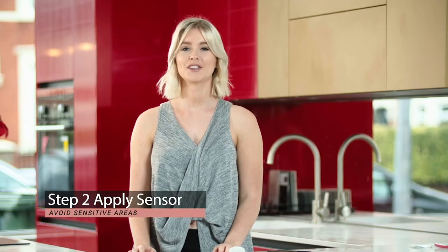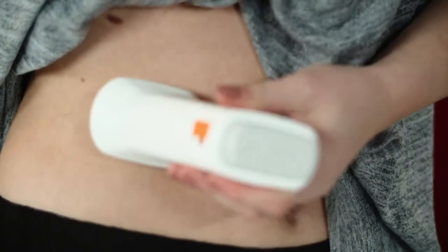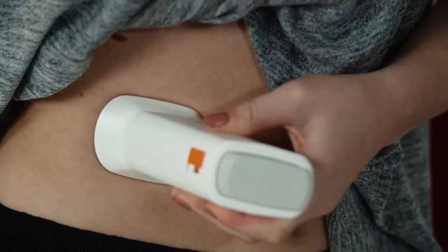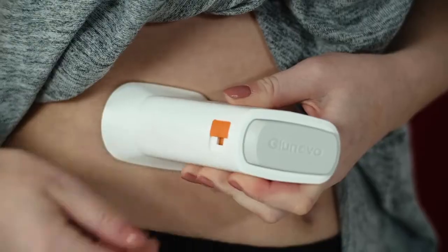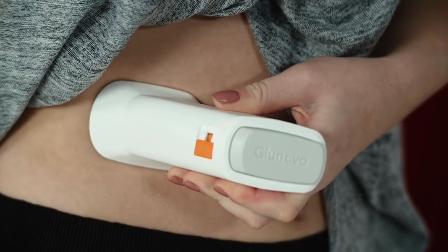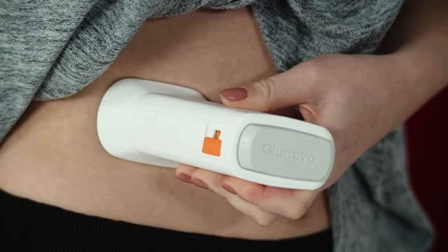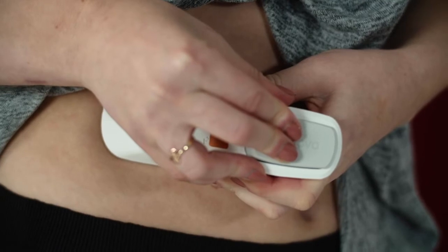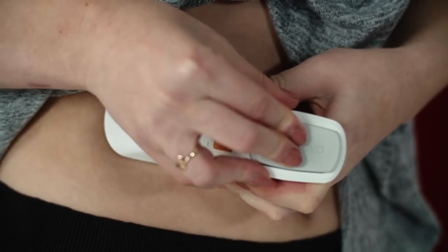Apply the sensor to your preferred location, avoiding the following areas: ribs, hips, scarring, tattoos, irritation, and any areas with hair. Once you're ready to apply the sensor, move the orange slider button from the lock position to the unlock position. Then click the applicator button at the top.